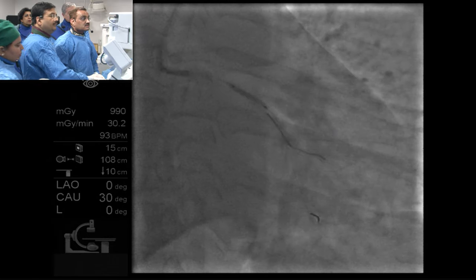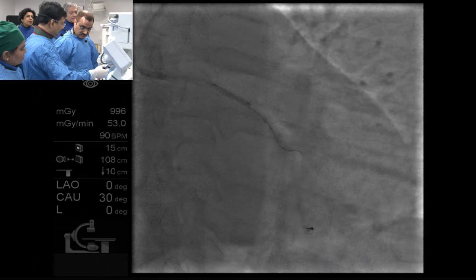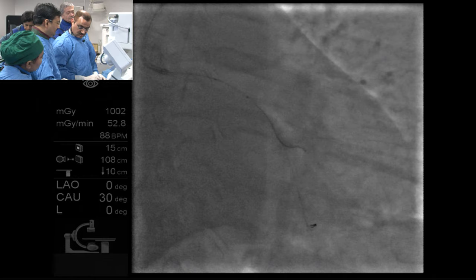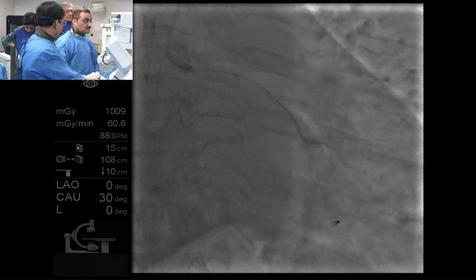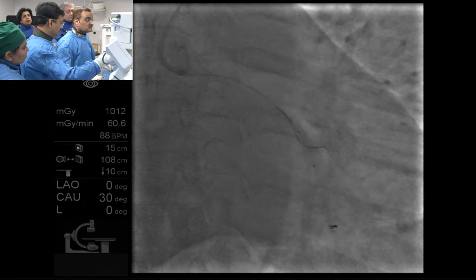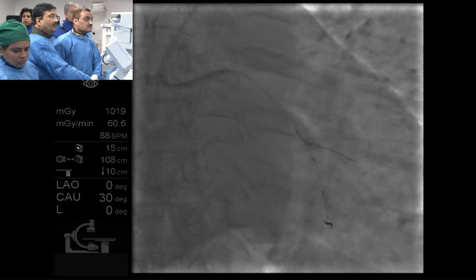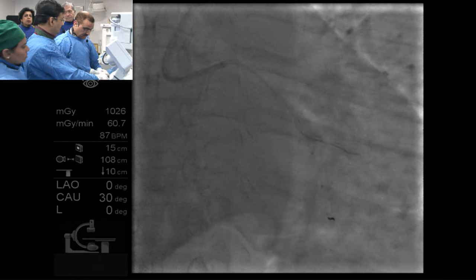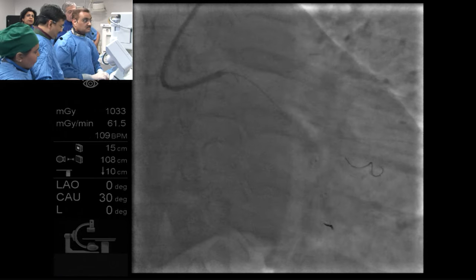Where is the stent gone? Stent is outside, in my hand. Oh, good, good. Thank God. When I say outside, you know, we don't know where. On the cath lab table. And I want to just advance this one in first. Guiding is still out. I know. The other balloon, I have this. That's better. That was a nice save, Tejan. Good work. It's stressful, but you did it well.